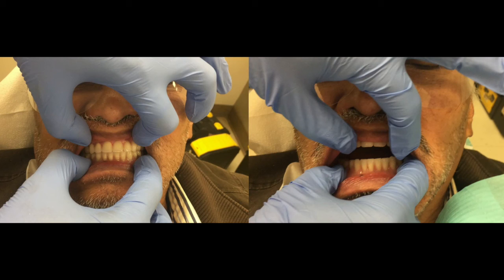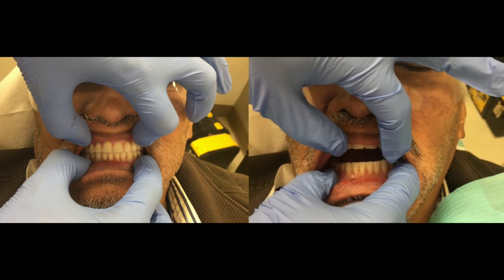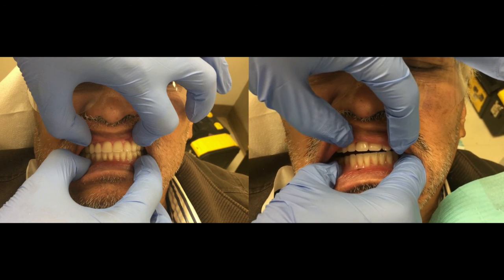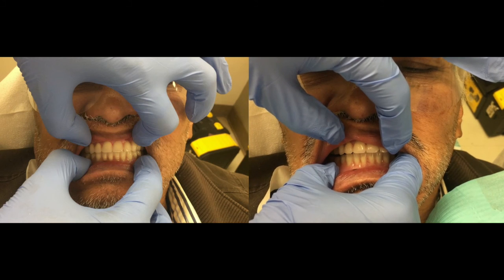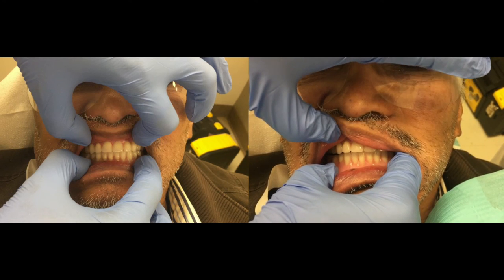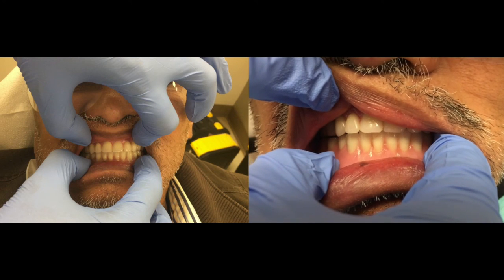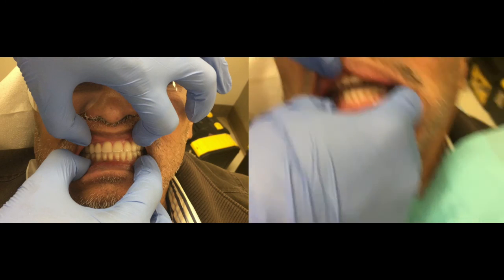Did you find any error in the occlusion? I will show you the second video. Relax more, and slowly close and gently touch. Don't close more. Get close to the left. You see the gap? Open. Okay.